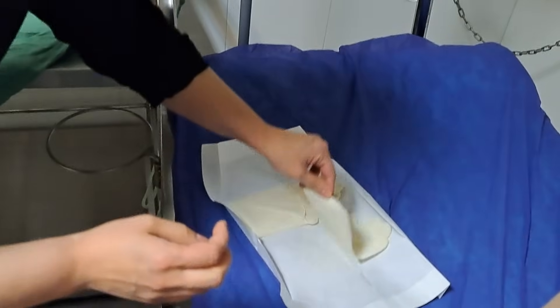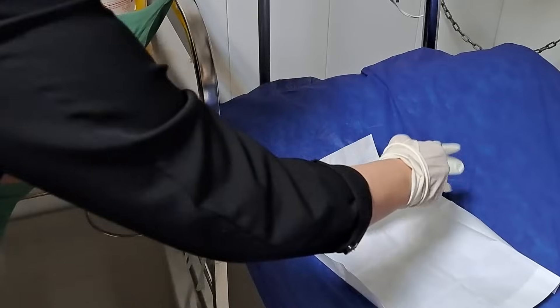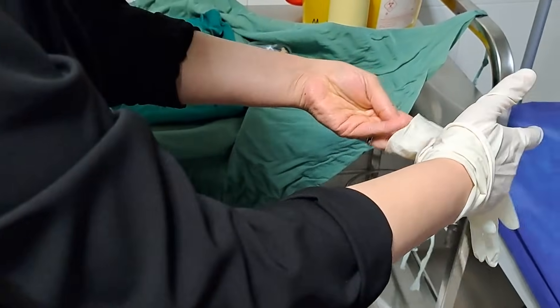The patient should lie on their side or sit leaning forward to curve the spine. This makes it easier to access the CSF.